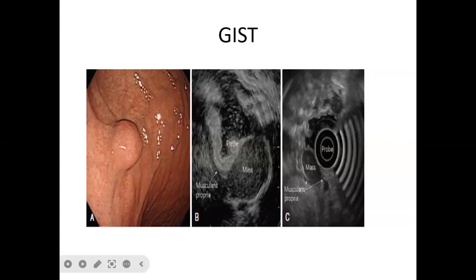So when we apply endoscopic ultrasound, there's a picture in the middle here. We're able to see clearly the lesion and how far it's going. Other than that, we're able to push in a needle and get some biopsy for analysis. That's a beauty that endoscopic ultrasound has brought.